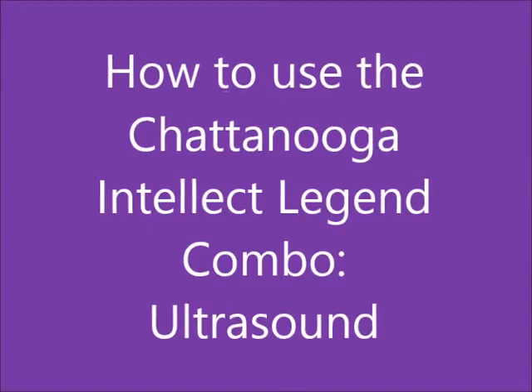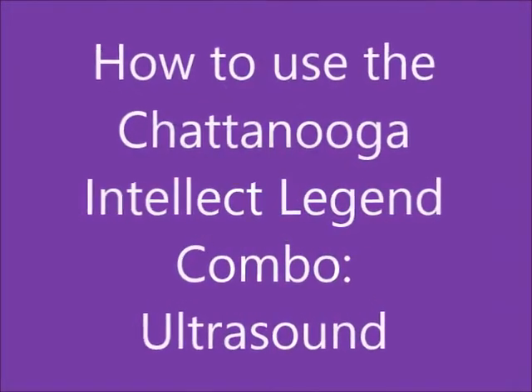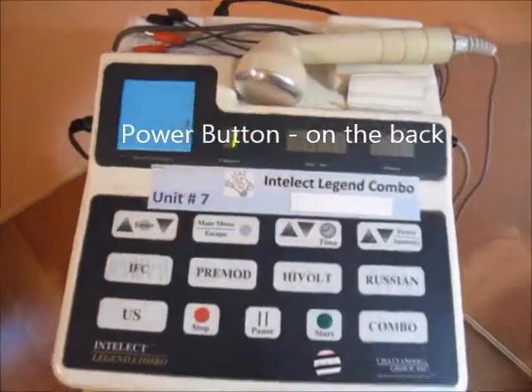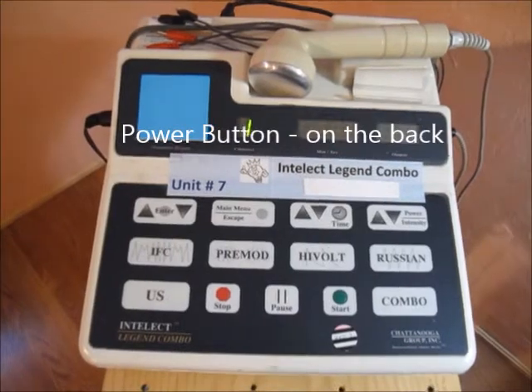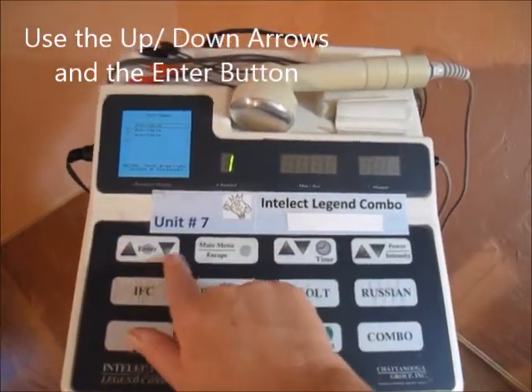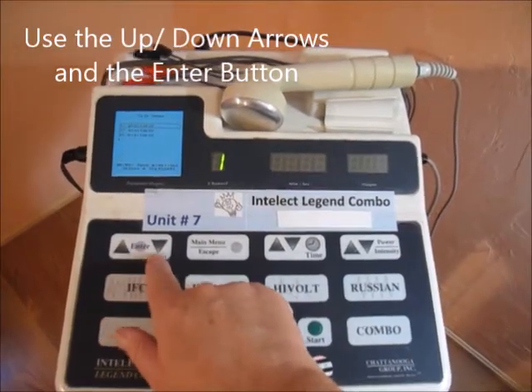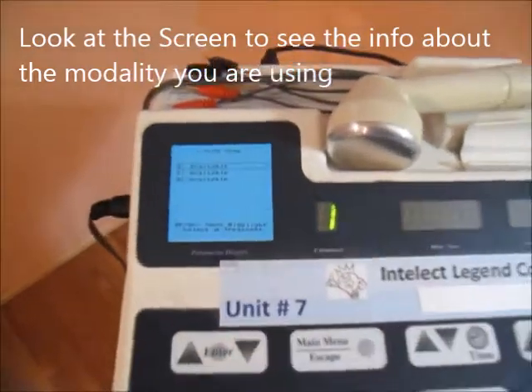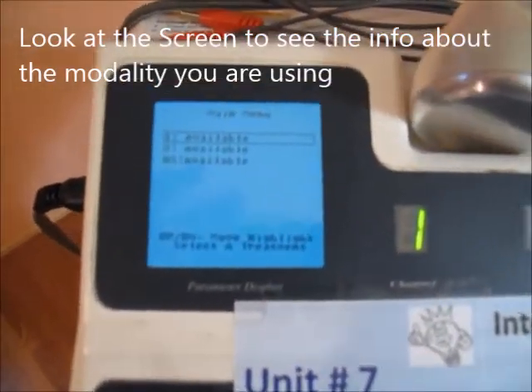How to use the Chattanooga Intellect Legend combo for ultrasound. The power button is on the back. There's a warm-up phase that will happen. Everything will be done toggling through this enter, up, and down arrow button panel. And this little screen right here is where we'll get most of our information.